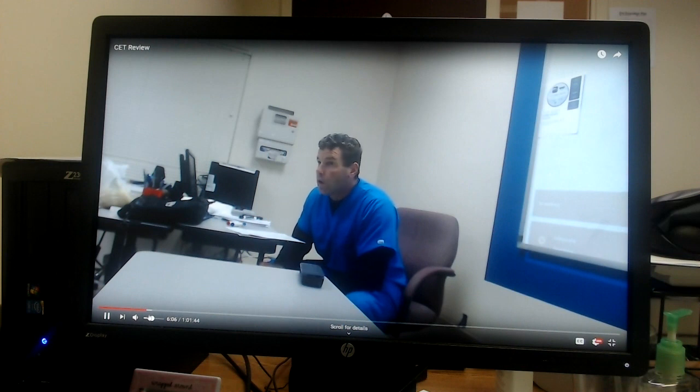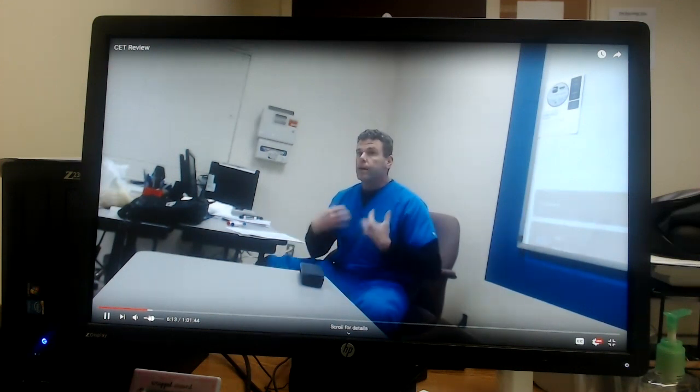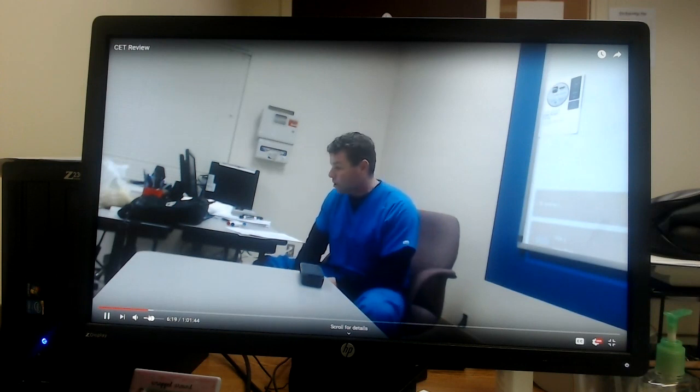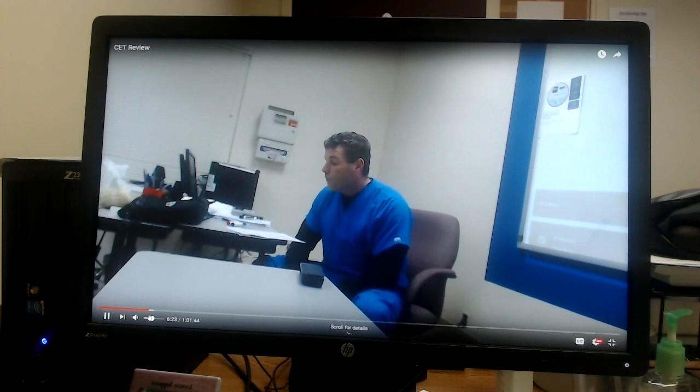Okay, they've achieved their target heart rate, whatever the case may be. When we did stress tests, we estimated what their max heart rate would be, and we wanted them to get to at least 85% of their max heart rate. So you continue the test. 16, which of the following locations should a technician use to measure blood pressure in a patient who is post-operative following a mastectomy on her right side?